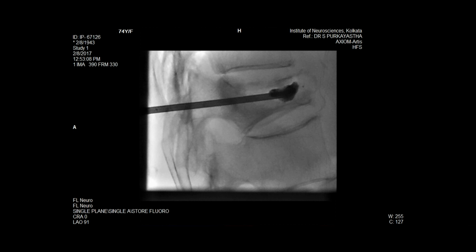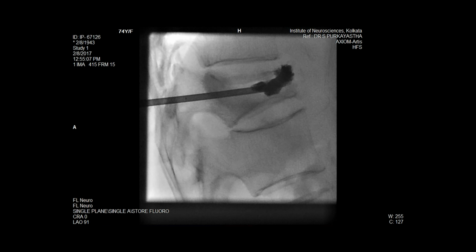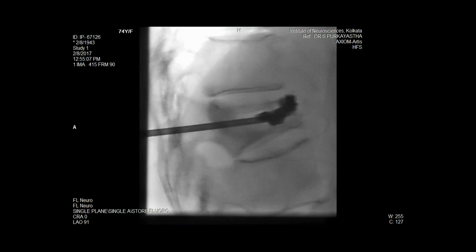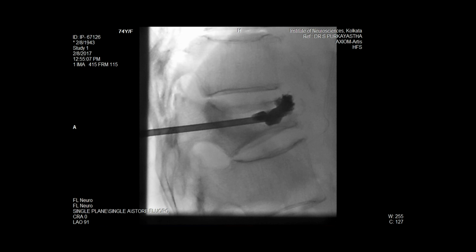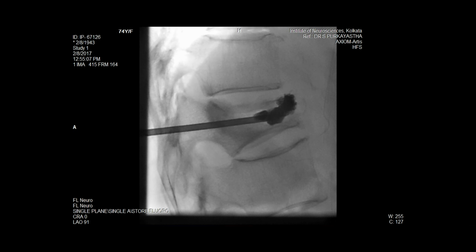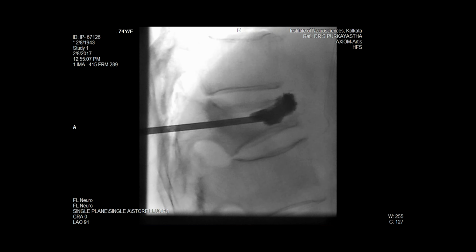By emitting heat inside that vertebral body, it burns the free nerve endings, and that's how it reduces the pain, and it glues the fractured bone, and that's how it prevents further fracture of the bone and further reduction of the bone height because it's already an osteoporotic vertebra. That means the bone calcium is less, and the patient can be mobilized within 24 hours or even within 48 hours. And most of the patients will experience at least 95% reduction of pain after vertebroplasty.